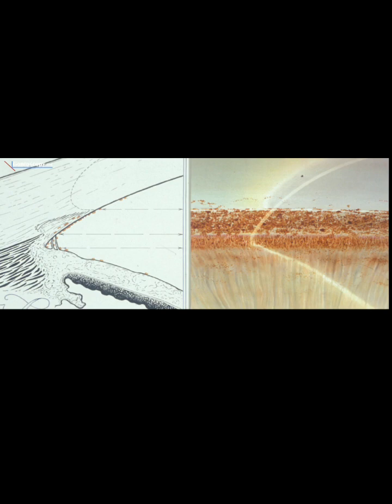This is that same exfoliation picture that I showed you. You can see a little bit of the ciliary body here. So this would be a D. It is flat. It's wide open, so 45 or 50 degrees, and 4+ pigmentation. So I would just write that in the chart as D50F4. I wouldn't put the word pigment in there.